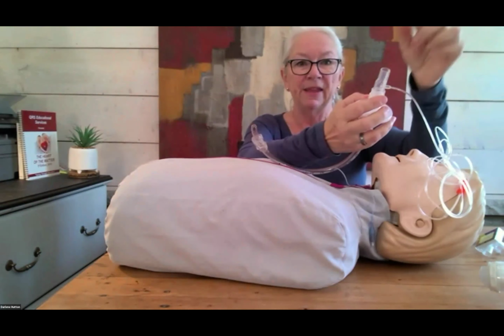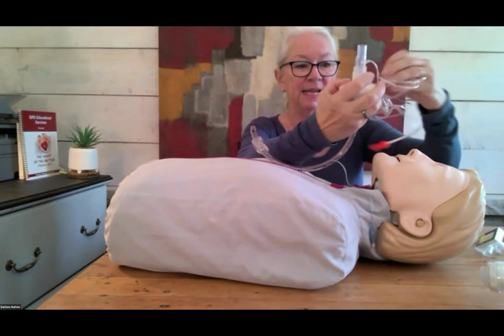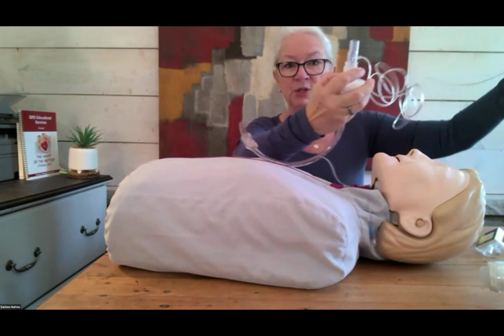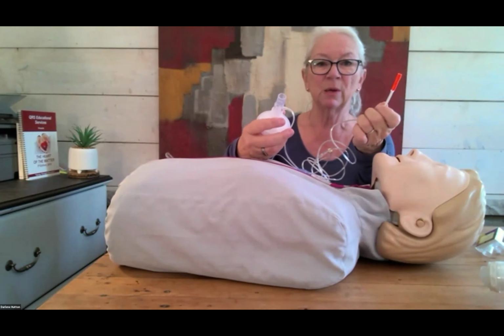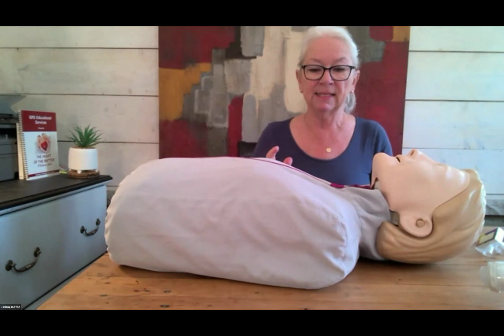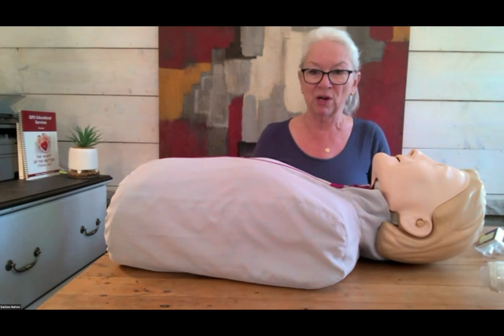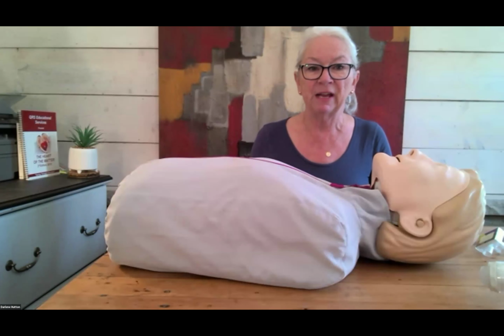And then you would put your ambu bag or hook them up to the ventilator. This is going to end up going to your cardiac monitor, and you will end up with a continuous waveform capnography. If your patient has a heartbeat and it's a good, strong heartbeat, you should see a number ranging between 35 to 45 millimeters of mercury.